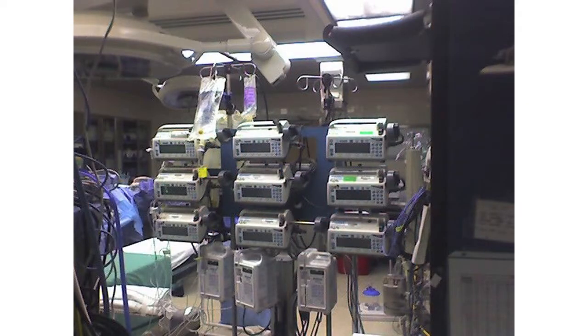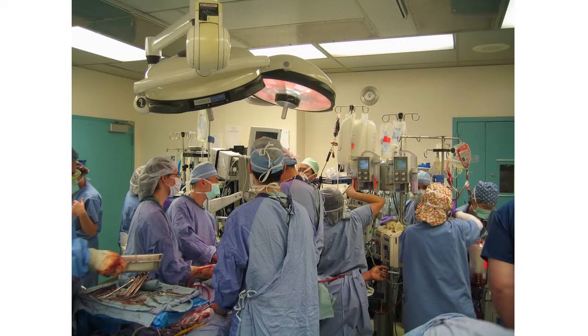So you have no idea what medication is actually being given to the patient, besides maybe down the road, if they had all the clock times correct on all these devices, so you actually knew what order things occurred in. This is what they call a pump tree because of the amount of medications being given to a patient. And this is a really sick patient, so not everybody has this many pumps, but this is quite frequent. So, more pictures of the OR, of what you're seeing and what's going on.